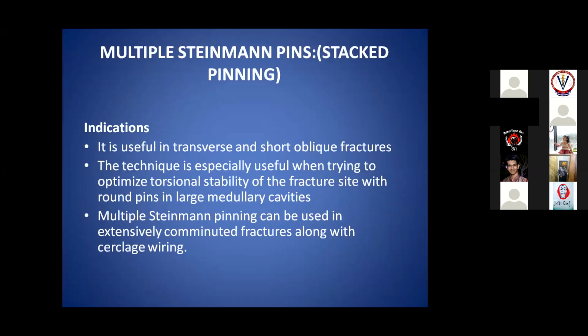Now, as I said, the possibility of migration of the pin is more if you use a single intramedullary pin. The alternative to this is using a stack. Stacking means putting more than one pin into the medullary canal. Instead of one, suppose you are using two pins. Now the contact points between the medullary canal and the implant will increase because you are using more than one pin. So there is less chance of migration when you are using this stack.